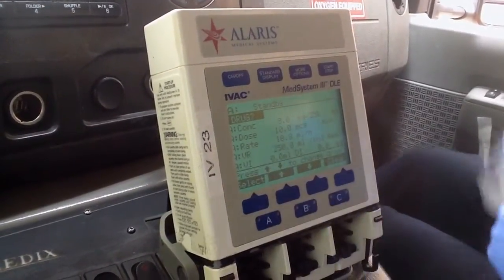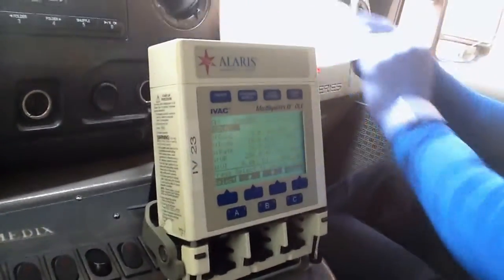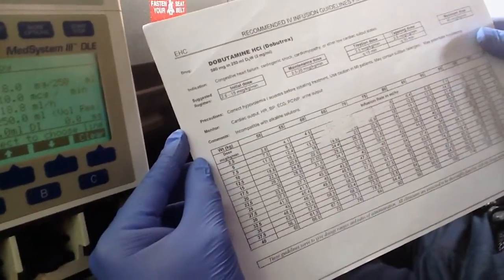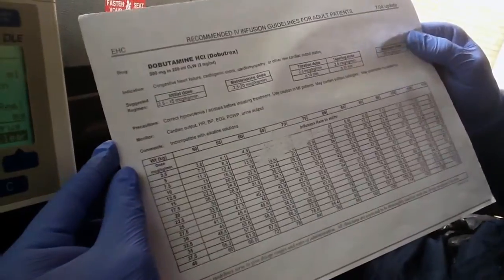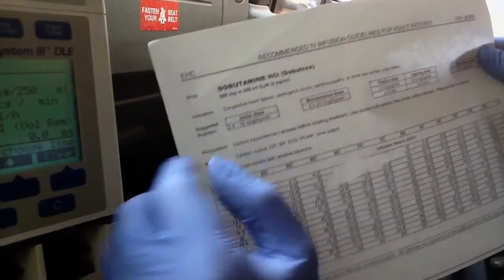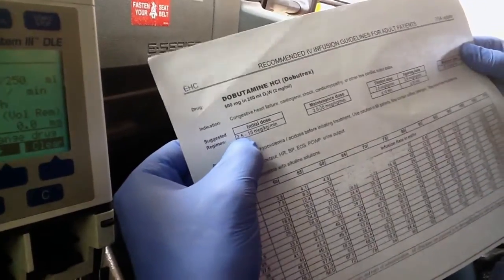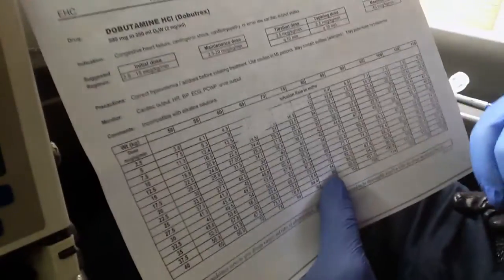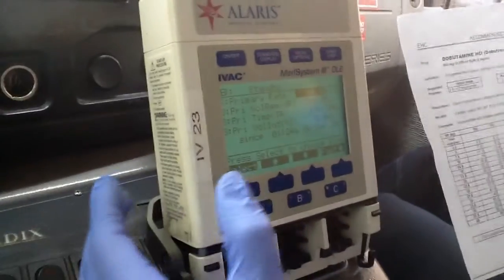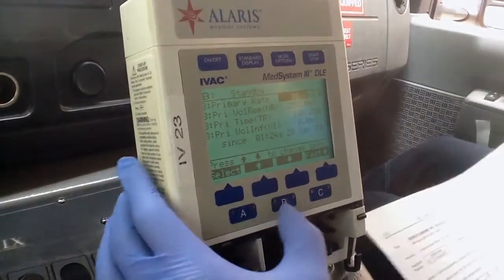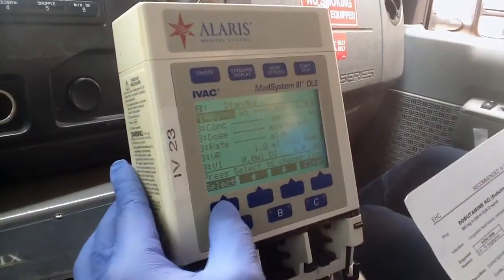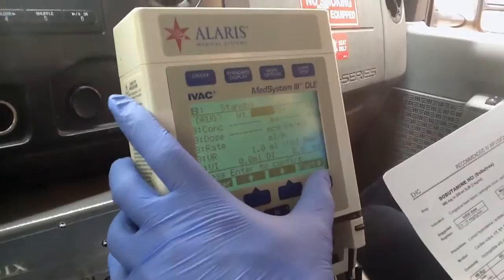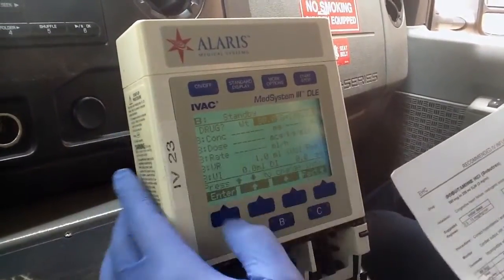Now I'm going to show you a weight-based calculation. This medicine is dobutamine — a potent medication for cardiac patients with inotropic and beta-1 effects. The concentration is 500 milligrams in 250 mL of D5W, and it's weight-based. The initial dose ranges between 2.5 and 15 micrograms per kilogram per minute. We'll use 80 kilograms. Go to Channel B, same operations — check, take syringe, label — then Channel B, More Options, Calc On. Select generic Drug, then enter weight: up to 70, 75, 80 kilograms, which the pump automatically converts to 176.3 pounds.